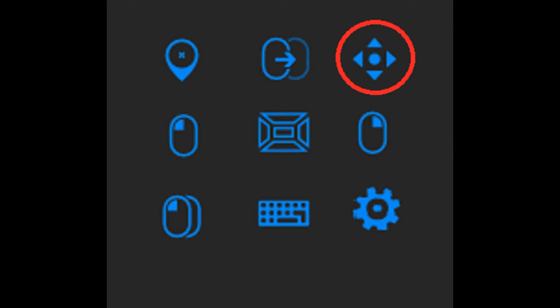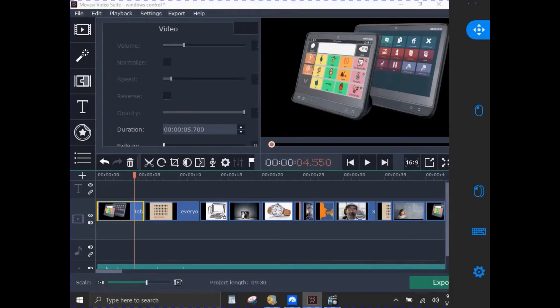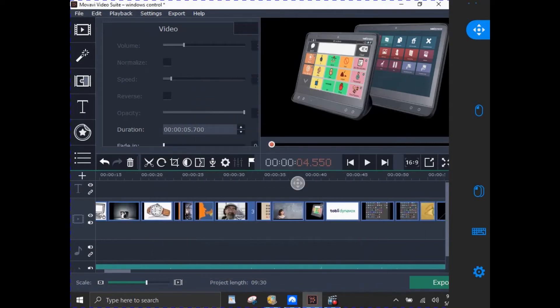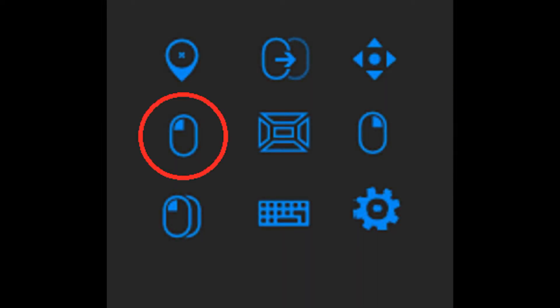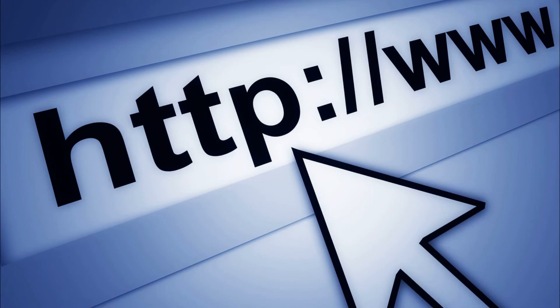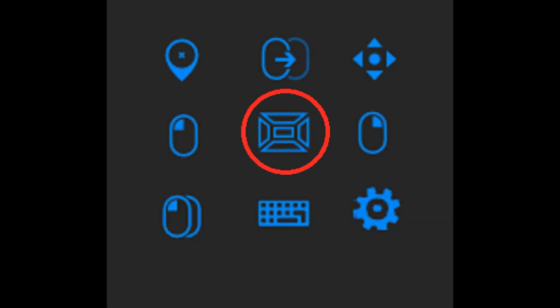The next icon looks like a diamond with a dot in the center — it's used to scroll. Usually you scroll up and down, but in Windows Control using this feature, you can scroll side to side as well on websites or documents. The next icon is the left click — just like the left click button on a computer mouse. It selects whatever you want on websites or programs, and it's the most used mouse function. The next icon is complicated to explain, so I'll save it for the end.